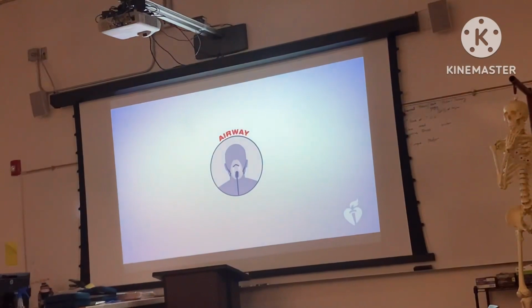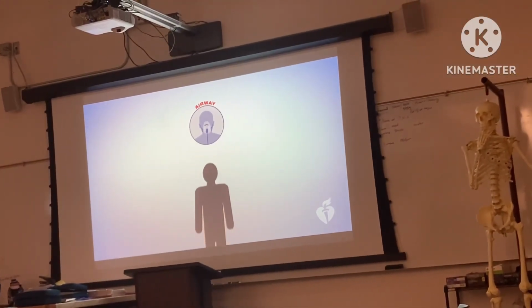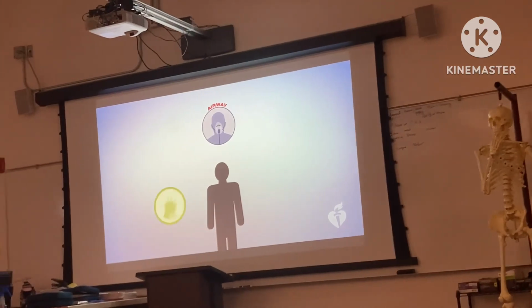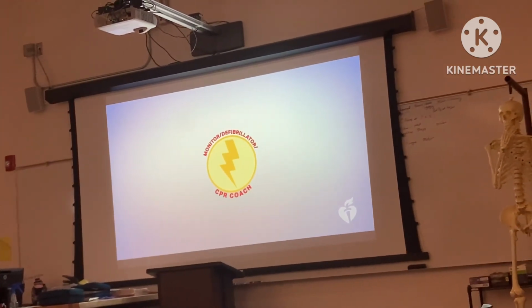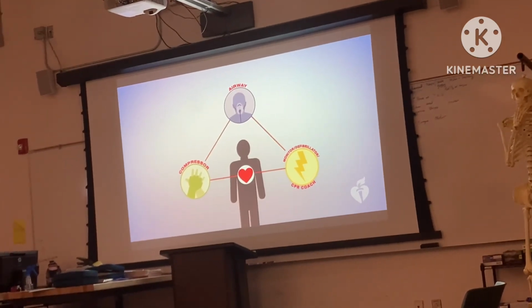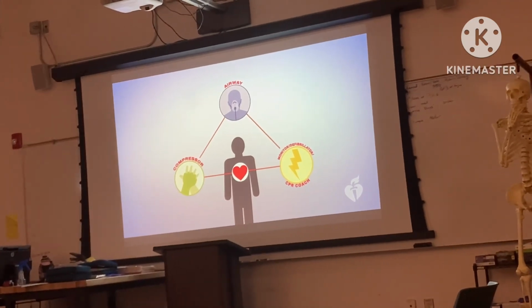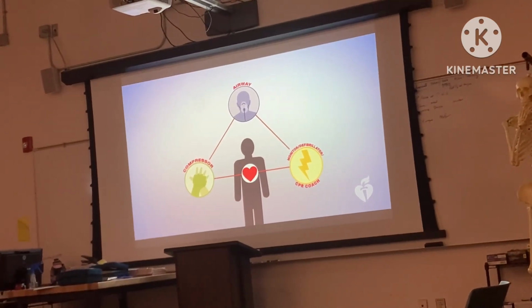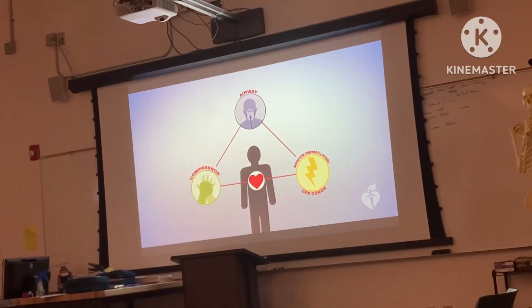The rescuer positioned by the victim's head maintains an open airway and delivers breaths while watching for chest rise and avoiding excessive ventilation. The team member operating the AED or the monitor defibrillator can also serve as the CPR coach. The role of the CPR coach is to focus on team members' performance of high-quality CPR and to provide feedback as needed during the resuscitation attempt.